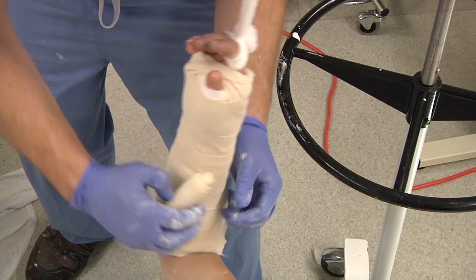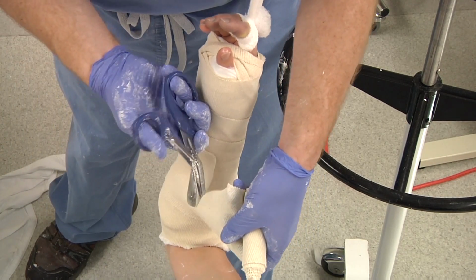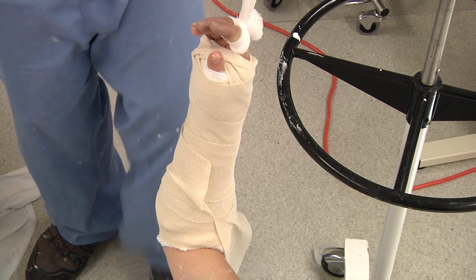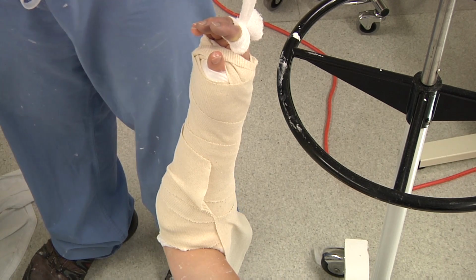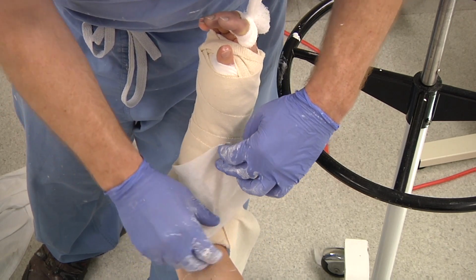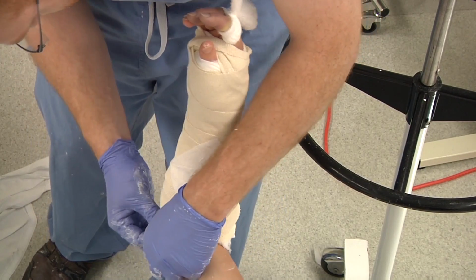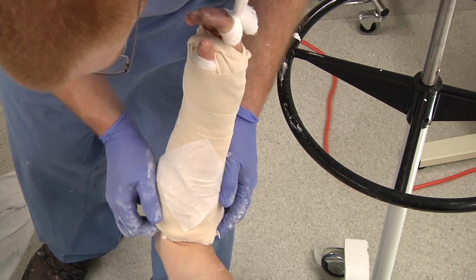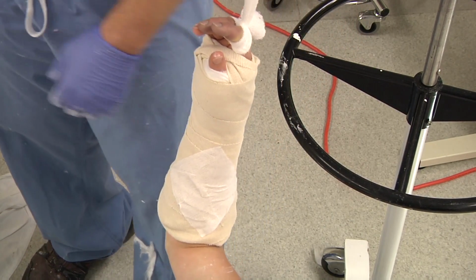From here, a little trick can be to cut it most of the way, leaving a little strand hanging on, let it dangle down, and then it is very simple to take your tape and, while it's got tension on it before it unravels, put a little piece of tape there and pluck that off. There, you can turn it at the tops, pluck away any excessive web roll, making sure you're still covered, plaster's covered. You need to tuck it under a little bit, making sure you're not over constricting in the cubital fossa. Just beautify your splint.